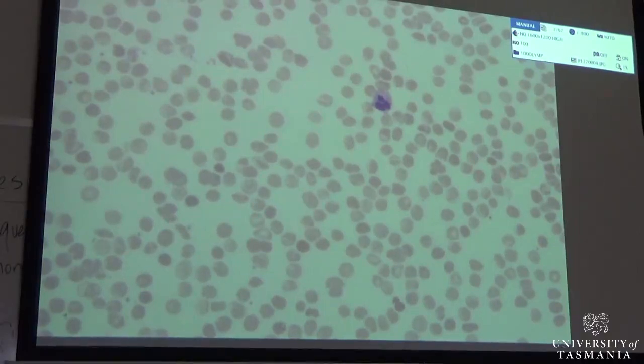And for sample code 1.3, with a white cell count of 2.1, the diff should have been something along the lines of neutrophils 52%, lymphocytes 38%, monocytes 5%, eosinophils 4%, basophils 1%. Don't worry if you didn't see any basophils, there was only 1% in there, so only 1 in 100 cells.